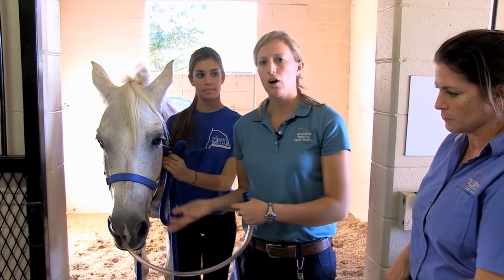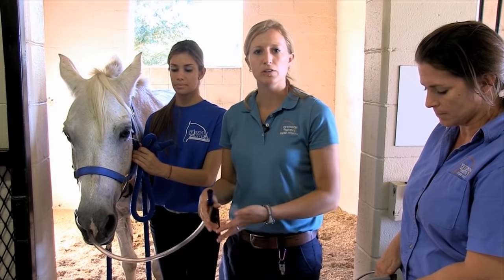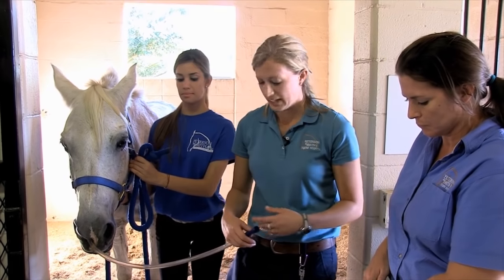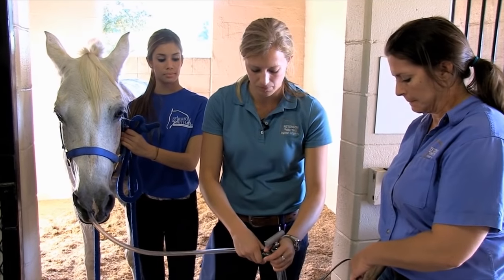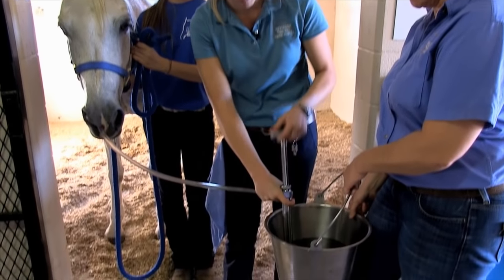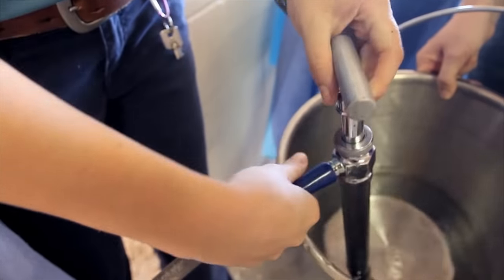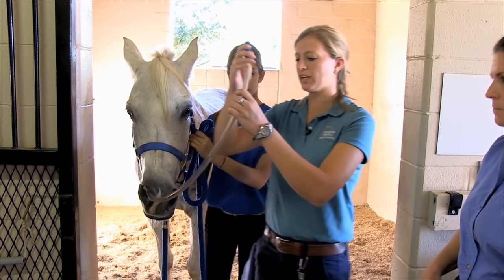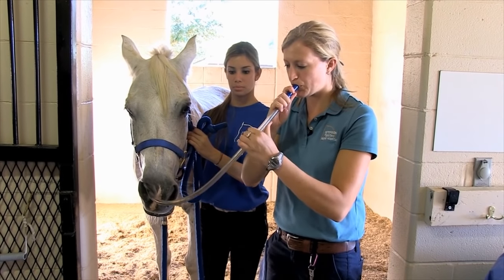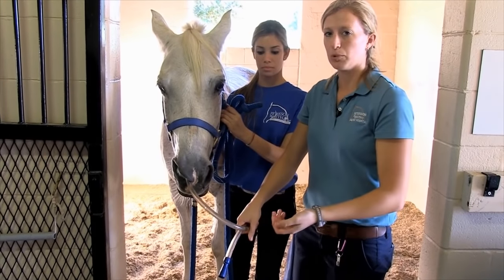If you're concerned about colic or reflux and need to lavage the stomach, you would keep going — often using one to two full buckets of water to get any sour feed or contents out. In this case I'm just going to give her a little more water to simulate giving a medication. I'll do a few pumps, then disconnect and blow the medication through the end of the syringe, kink it off so nothing comes back, and then pull the tube.